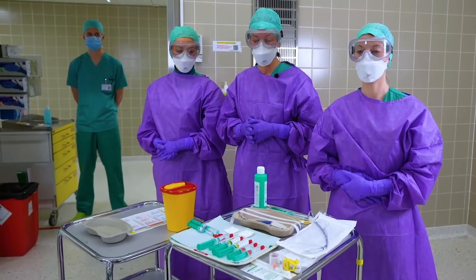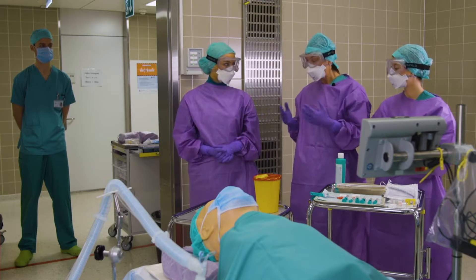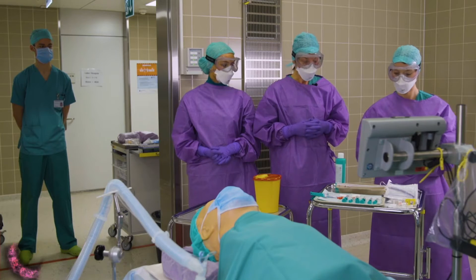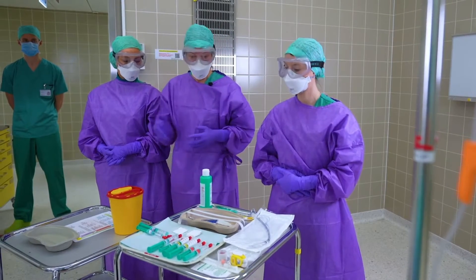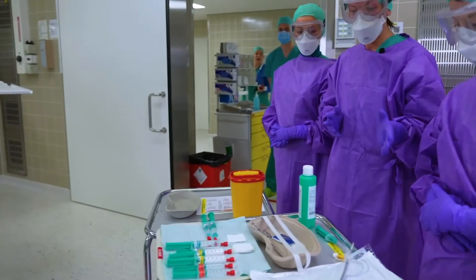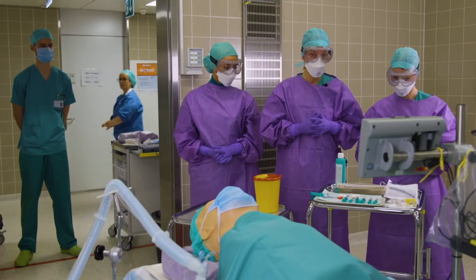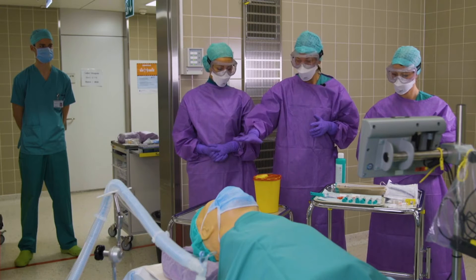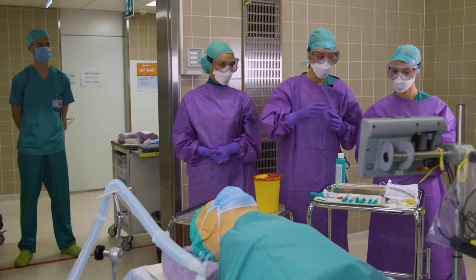First, we have the planning phase. As you can see, we are all donned in protective gear according to your local SOPs. We did our body check and we deemed each other appropriate for this procedure. For induction, we have our medications on the tray, as well as our airway materials, including an endotracheal tube with a stylet in place and our video laryngoscope. Next to the induction table, we have our dirty tray for dirty materials to be disposed there. It's also important to have a trash bin next to the patient so you can drop dirty articles right into the trash bin.